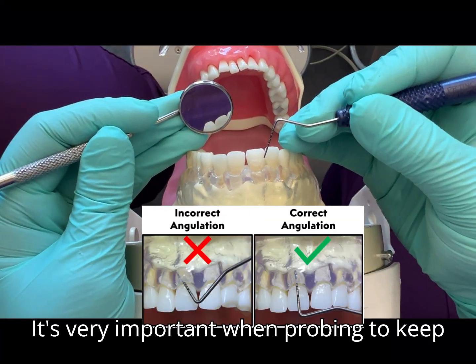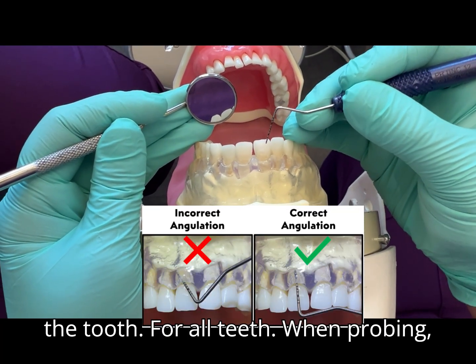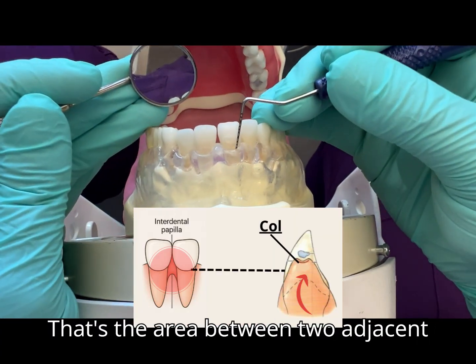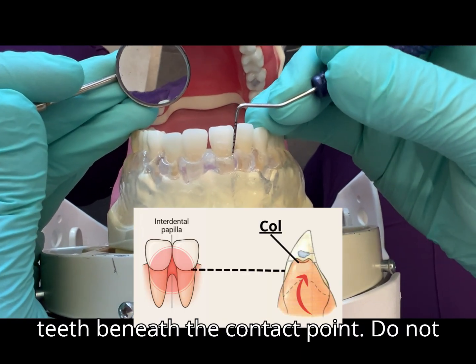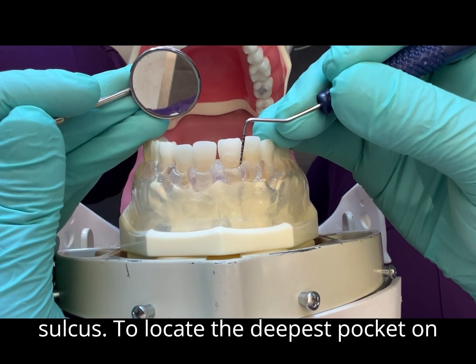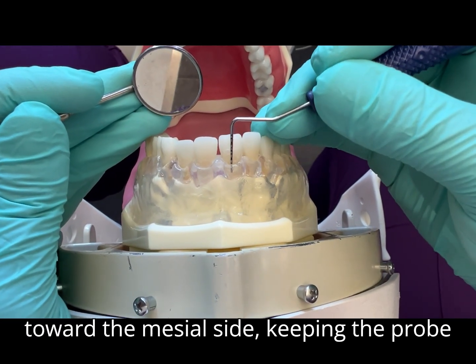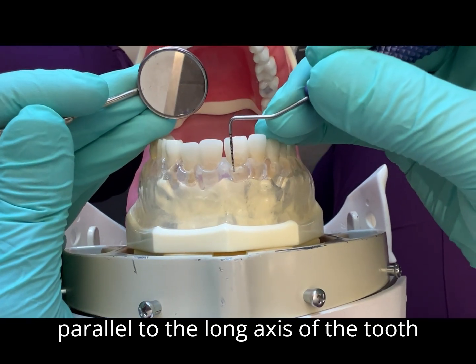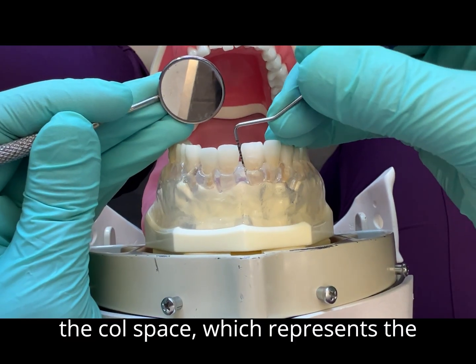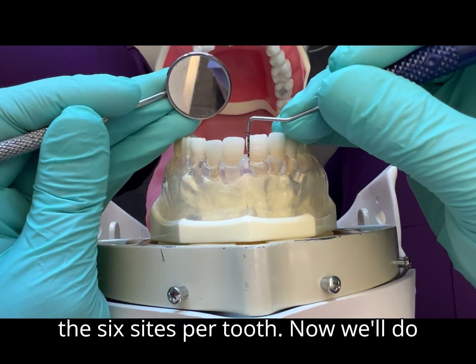It's very important when probing to keep the probe parallel to the long axis of the tooth for all teeth. When probing, start at the distal line angle and gently walk the probe toward the col space. That's the area between two adjacent teeth beneath the contact point. Do not remove the probe between sites. Instead, keep it in place and walk it along the sulcus to locate the deepest pocket on the midfacial surface. Continue walking toward the mesial side, keeping the probe parallel to the long axis of the tooth. At the mesial, remember to measure into the col space, which represents the interproximal area. You should always record the deepest reading for each of the 6 sites per tooth.